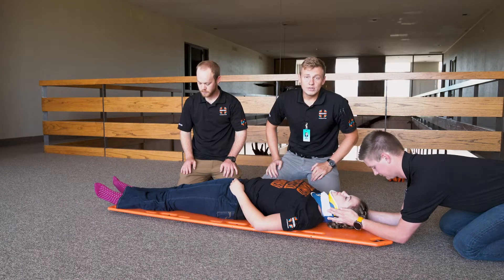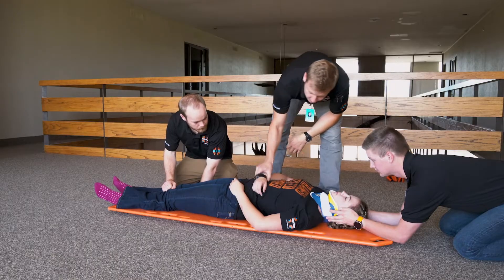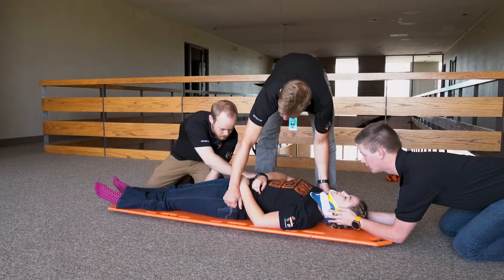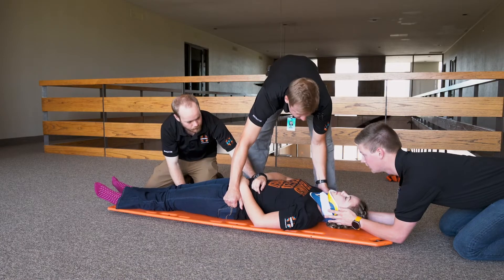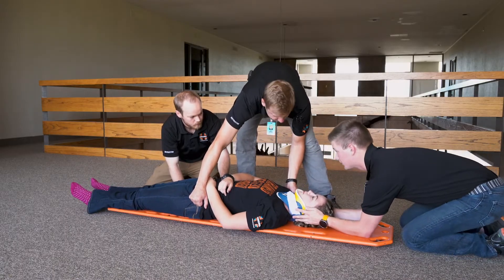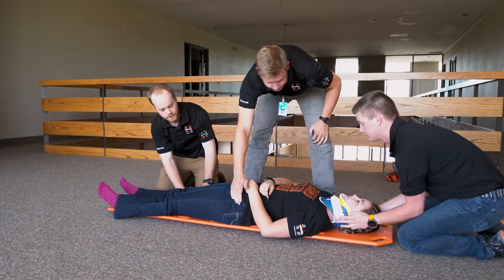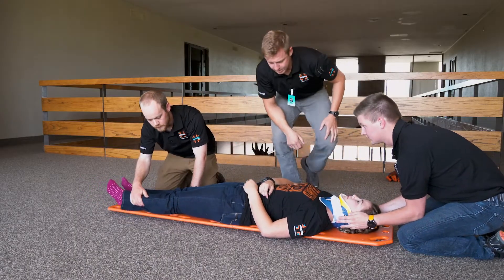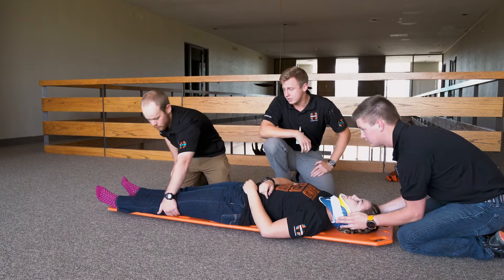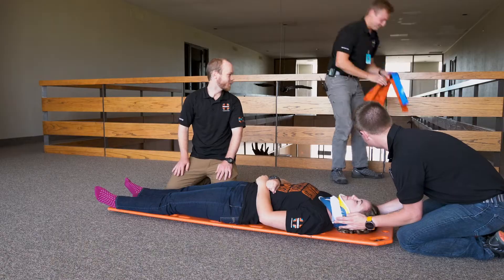Make sure your patient is properly centered and positioned on the board. We're going to slide towards the patient's feet and center her. One, two, three. Back towards your head — one, two, three. Looks good. We're going to assess and pad for any voids underneath the patient. No voids.